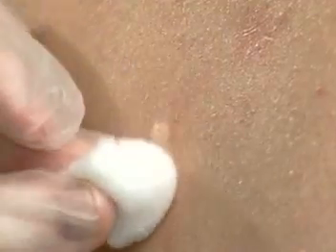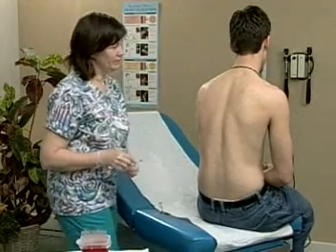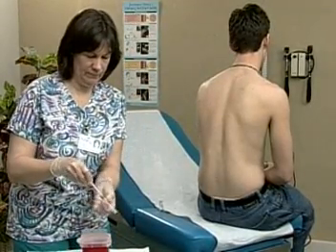Withdraw the needle. Blot gently with a cotton ball if necessary. Okay, Todd, that's it. Right here. And dispose of the safety needle and syringe.